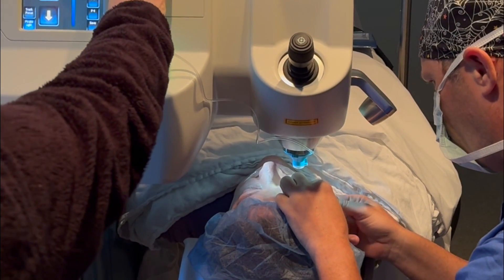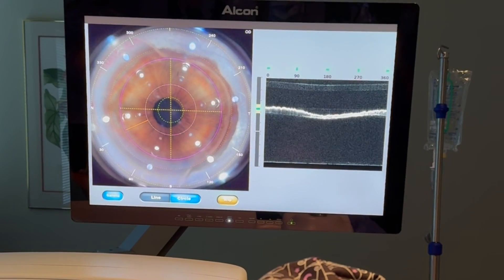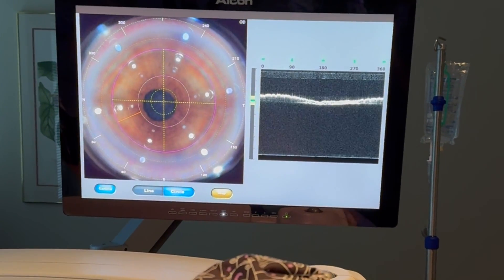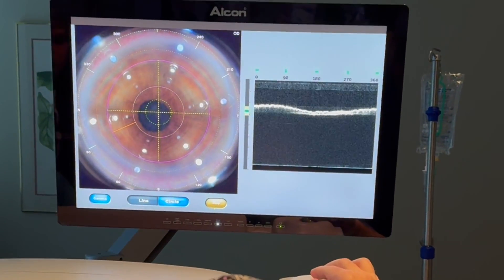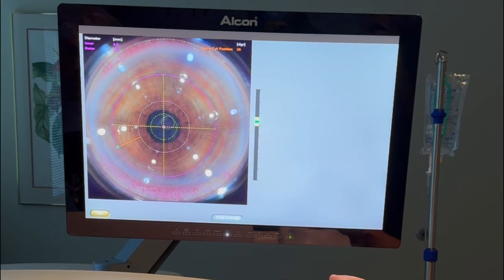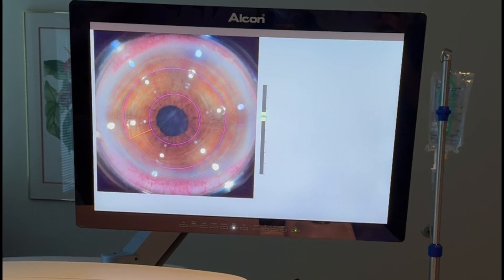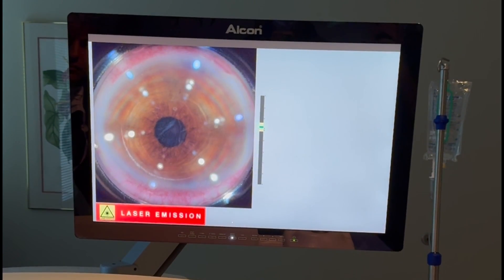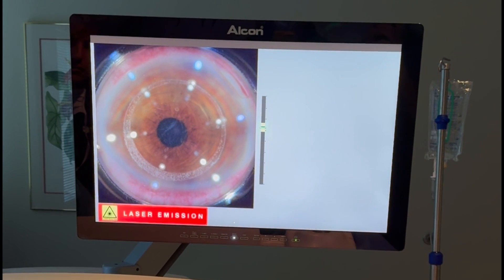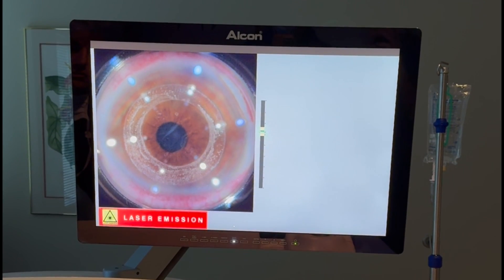Here we are in the laser room, just talking to the patient using a little verbal anesthesia. We're going to dock the laser on the cornea, centering over the pupil. In this case we're using the LenSx laser to create the lamellar channels — and to my knowledge this is the first time that the LenSx has been used for this application, and it worked beautifully. I really do have to thank Alcon for coming in the day before and working with me to make sure this would work. Here you can see we're beginning to create the lamellar channel, all based on the surgical map sent to us by Corneagen.